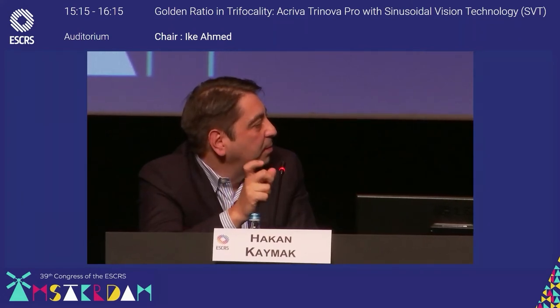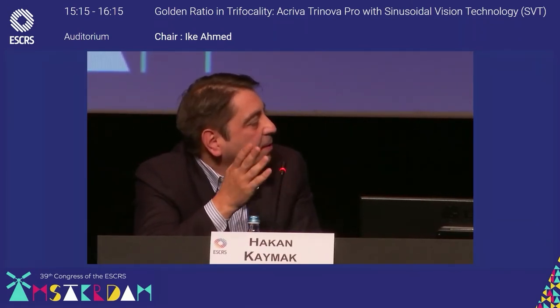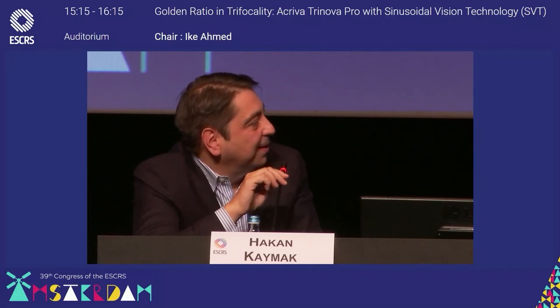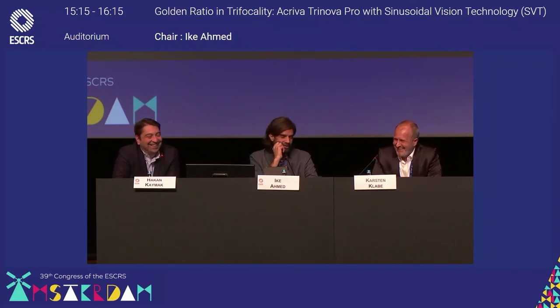But there's a little bit of bias because the pupil centration differs between preoperative and postoperative, and the centration of the IOL depends on the pupil size under mesopic and photopic conditions. Well, it's a little bit theoretical. I think you win when the lens is in the capsular bag. That's a good take-home line. You win when the lens is in the capsular bag. So don't break the posterior capsule. That's the lesson there. Very good point.